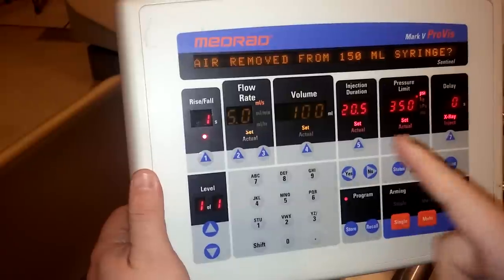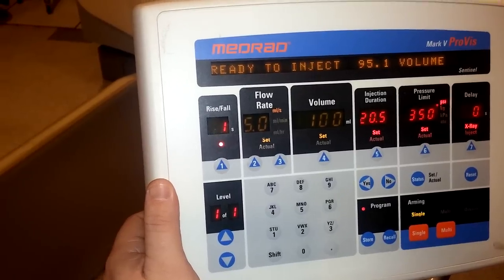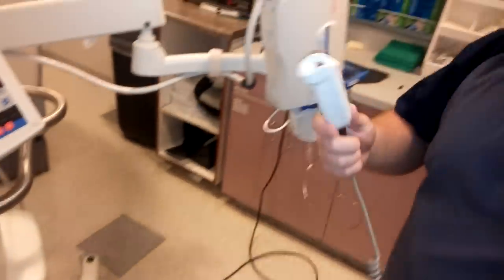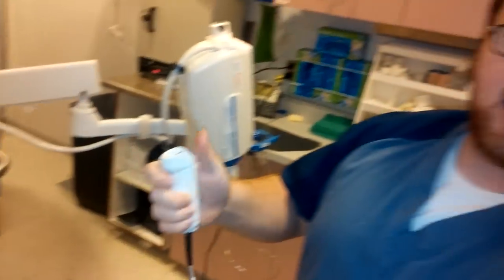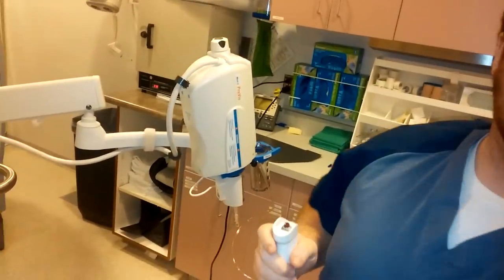All the air is removed, so yes, and we're ready to inject all the contrast. In order to inject the contrast you hit this button, but you have to depress it the entire time — do not let go or else it won't work.